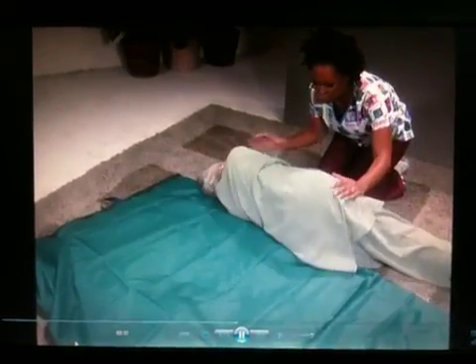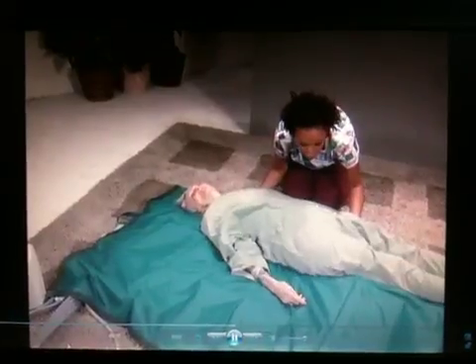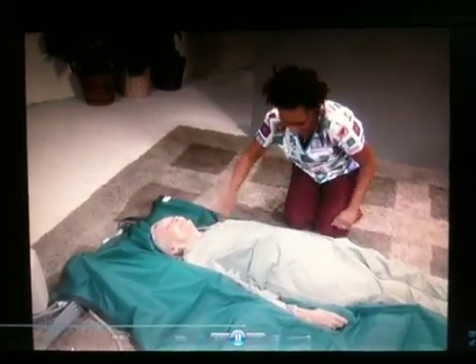With a log roll movement, roll the person onto the slide sheet. Place one hand on the person's shoulder and one on their hip. Then gently push the person towards the center of the camel. Once the person is in the correct position, the slide sheet is gently removed.